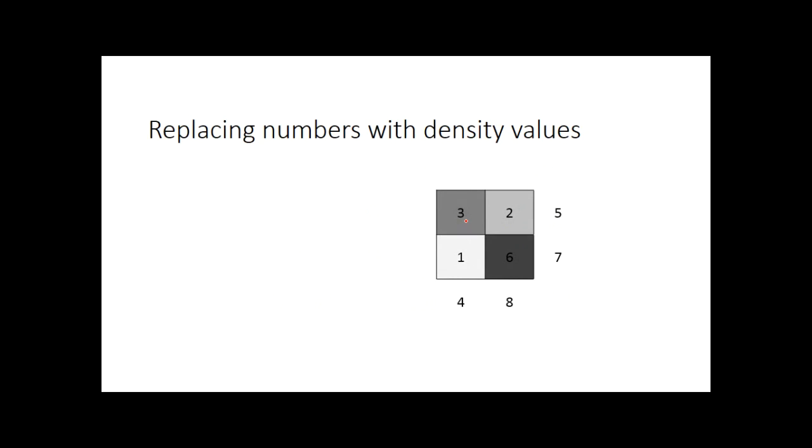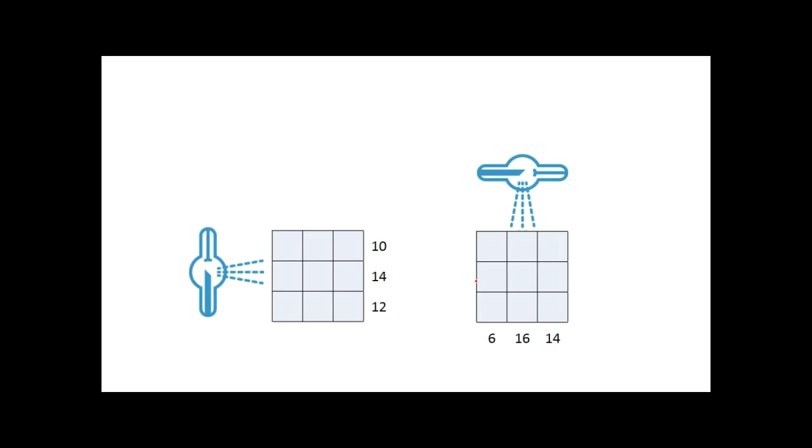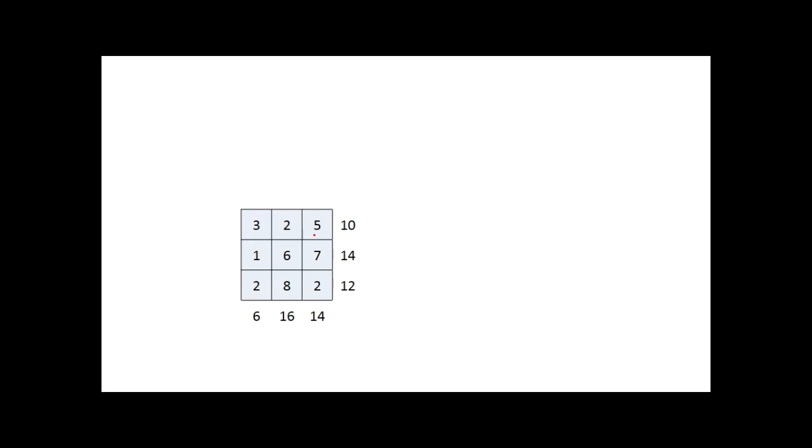And then it will replace these exposure values with density values. Now we have a basic matrix of a CT image from 2 projections only. To make it more complex, increase the angles at which the exposure is made, and increase the matrix size. Apply the same method, and we'll again get a matrix with values, replace it with density values, and you get an image.